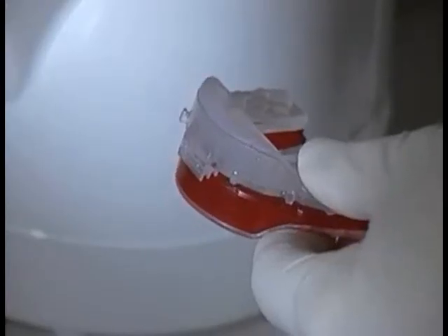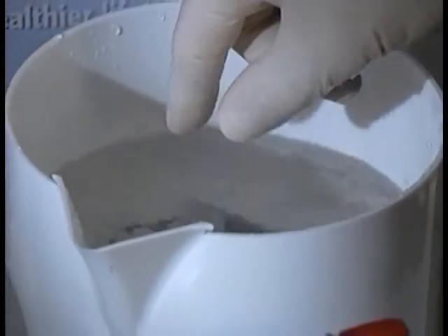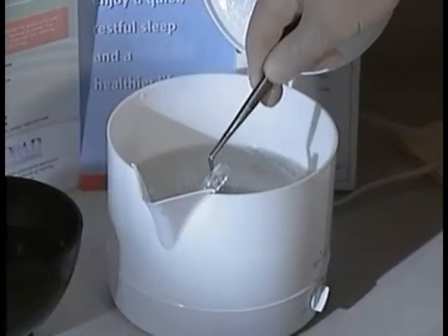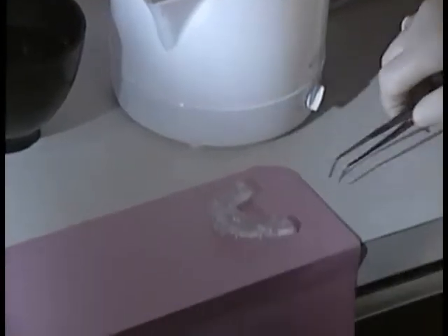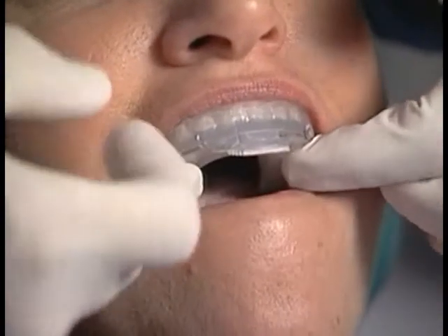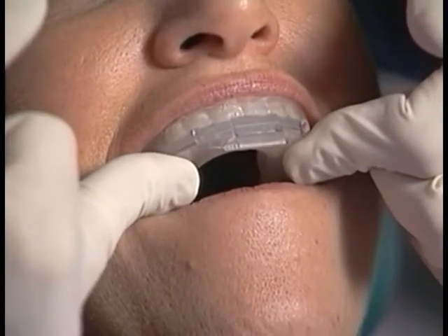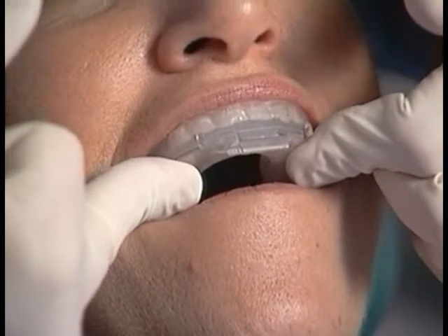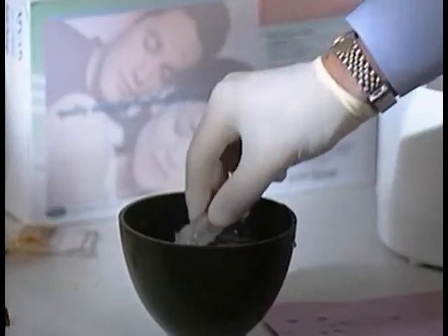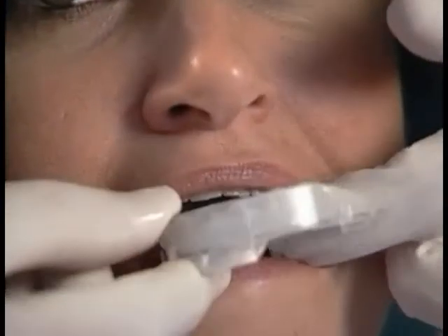Once you're ready to begin, place the upper clear device in the thermostatically controlled hot water pot in rapidly boiling water for 3 minutes, or in the microwave. Remove from boiling water and let it cool for 30 seconds before inserting in the patient's mouth. The device still may feel hot, even slightly uncomfortable, but there are no harmful effects. The device should remain seated for 5 to 10 seconds. Then remove, rinse it under cool water, and immediately place it back in the mouth.